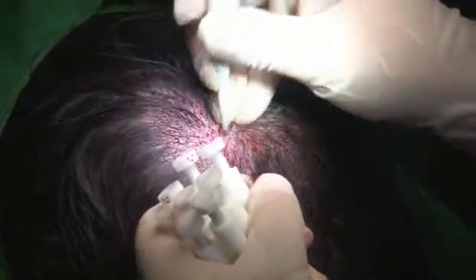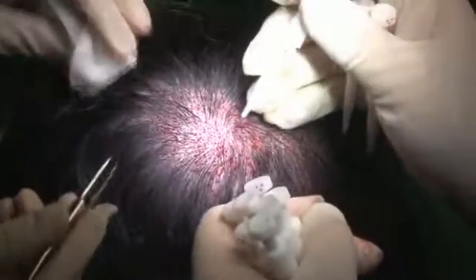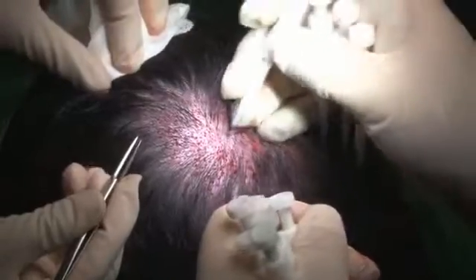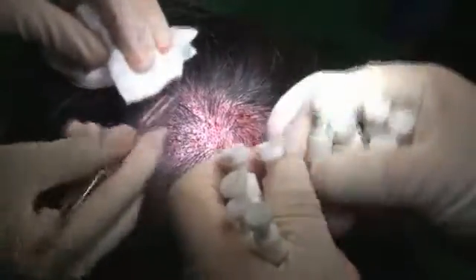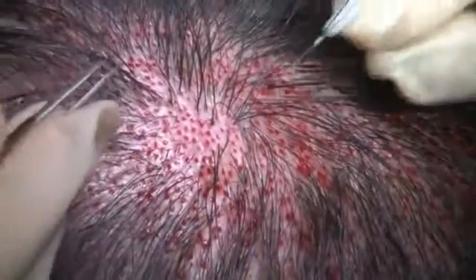First, I grasped 10 loaded 3-hair implanters in my left hand and passed them one by one to my right hand to place the grafts. The emptied implanters stay in my right hand until I'm holding seven of them. Then I pass them to the technicians for reloading.